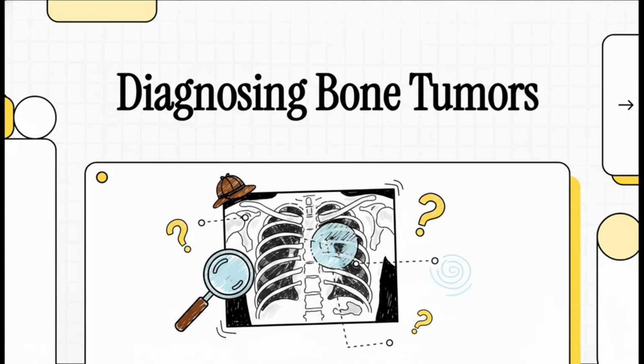All right, today we're putting on our detective hats. We're going to take a look at a single X-ray, one with a pretty suspicious-looking spot on it, and figure out how doctors solve these kinds of mysteries. We're going to decode the clues hidden inside our very own bones, clues that can solve some really high-stakes puzzles. So, let's get into it.